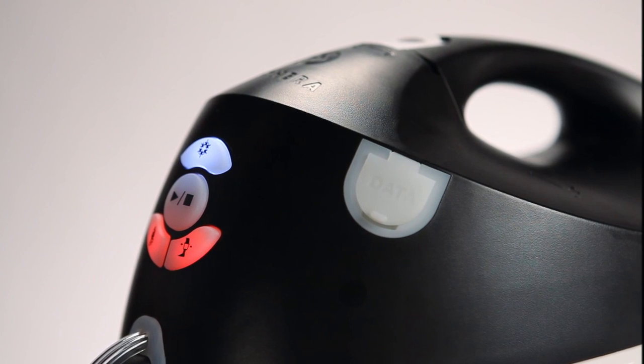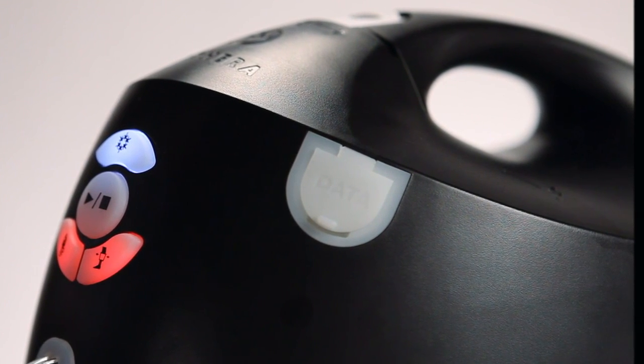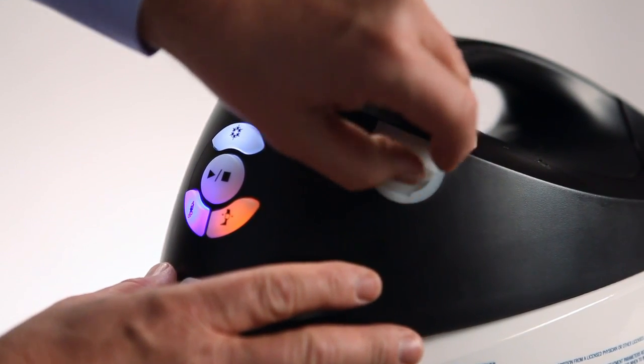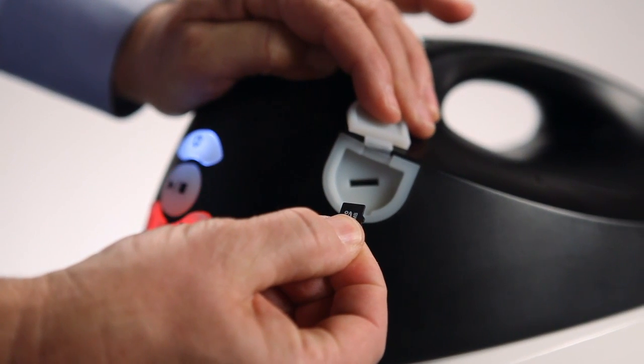When finished using the vPulse, it is important to send back the microSD card located in the data port in the front of the vPulse. To remove the card, open the door, press in on the card and it will pop out. Pull the card out and place it in the return mailer provided.